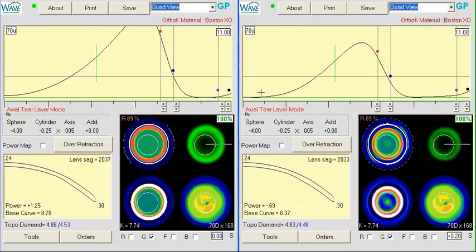Okay, so you can see the new lens, it bears a lot more centrally, and it does kind of push this tear graph out a little bit. We're out to 3.45. So still, it's not a huge difference from where we started, which was right around 3. But this seems to give us maybe a little bit more than we would get just by increasing the size of the OZ and the IC.